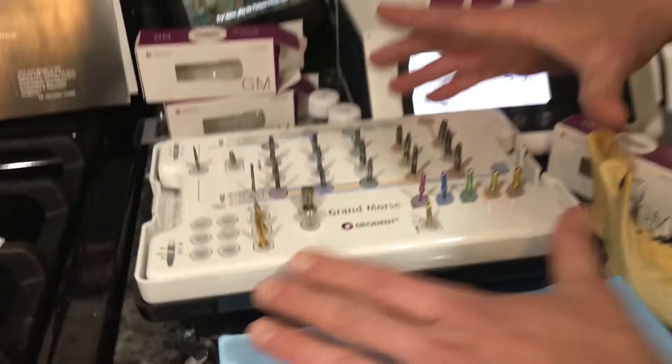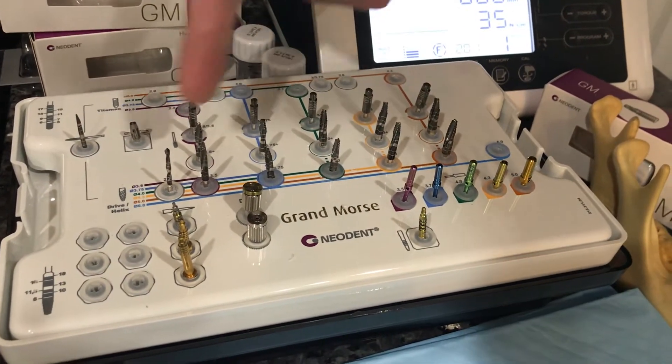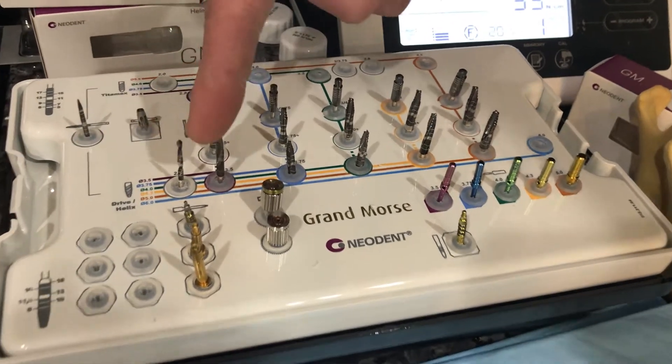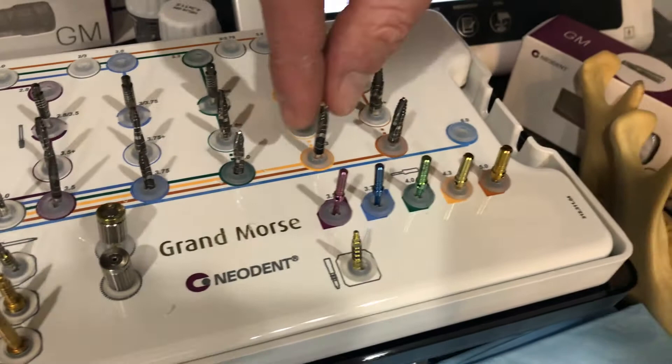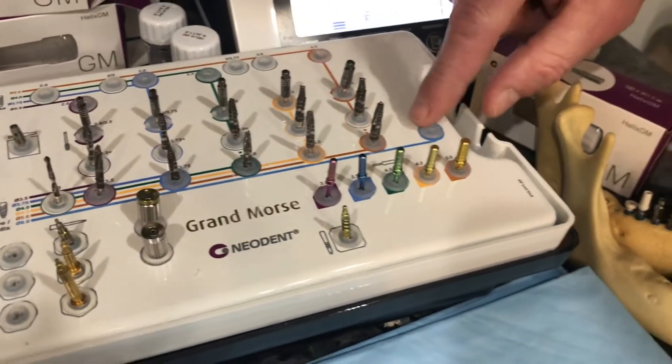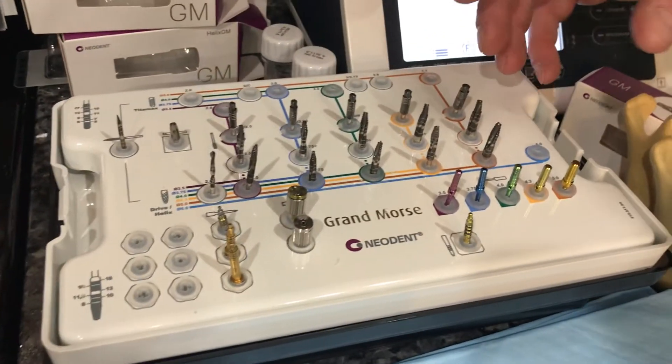Looking at the surgical kit itself, we start from left to right with a 2.0 drill. Next is our 3.5 drill, 3.75, 4.0, 4.3, 5.0, and then our 6.0 drill, which is not in this kit today. We work from left to right and gradually open up our osteotomy.